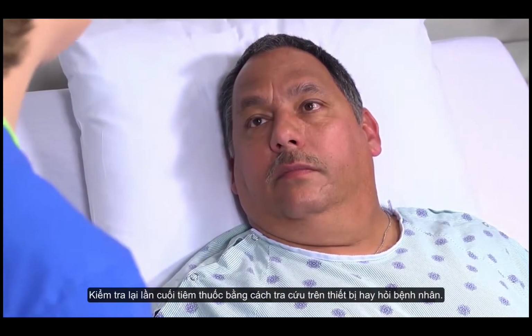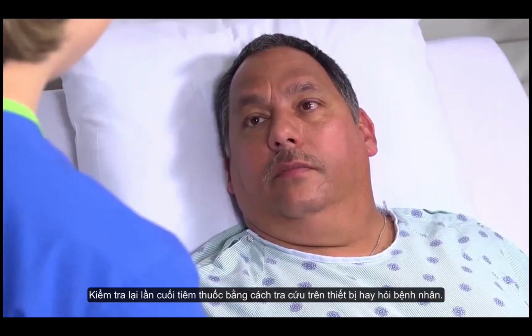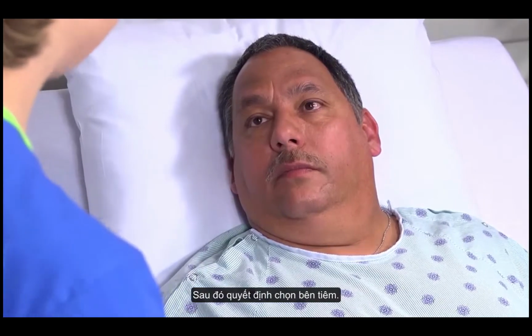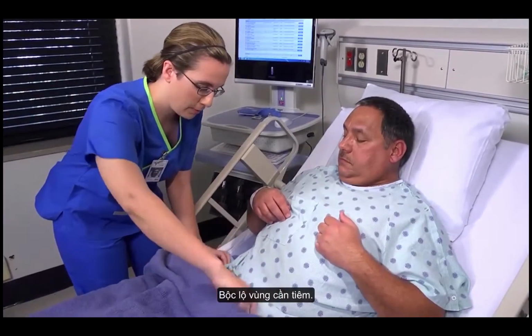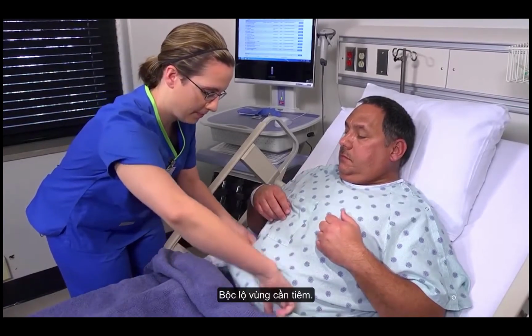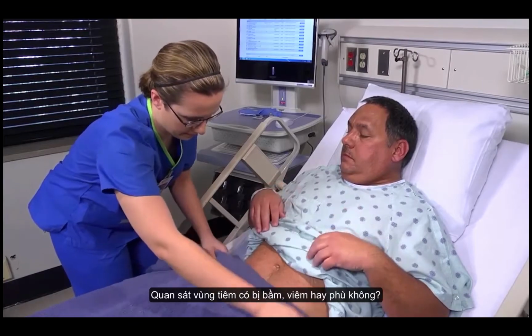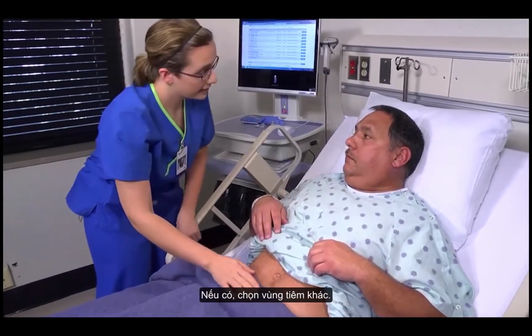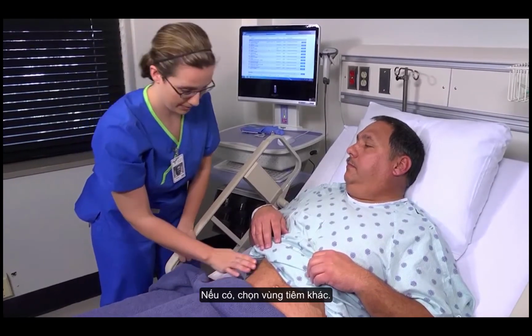Find out where the last injection was given by checking the MAR and/or asking the patient. Then determine which site you'll use. Shift the patient's bed linen to expose only the potential injection site and surrounding area. Inspect the area for bruising, inflammation, and edema. If the skin is bruised or shows signs of infection, use a different site.